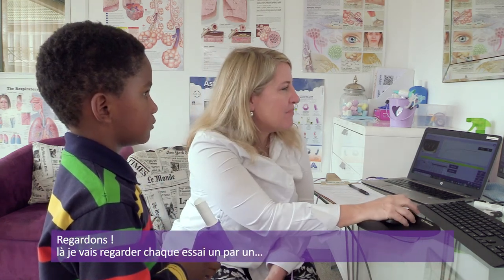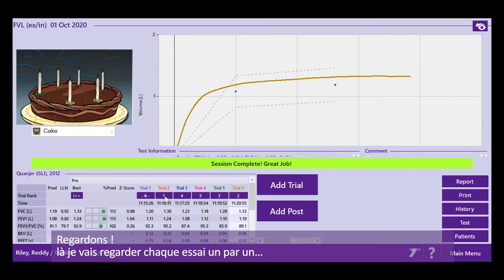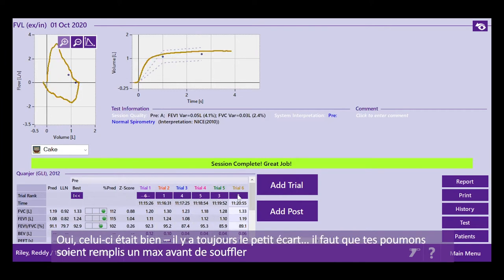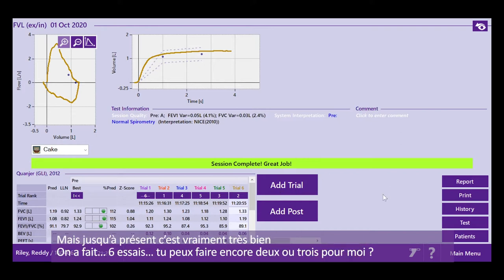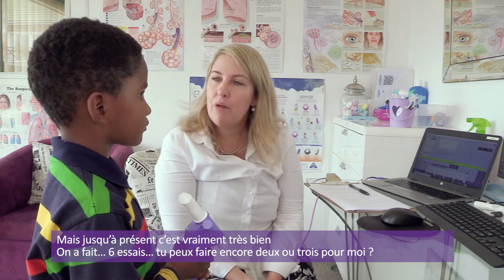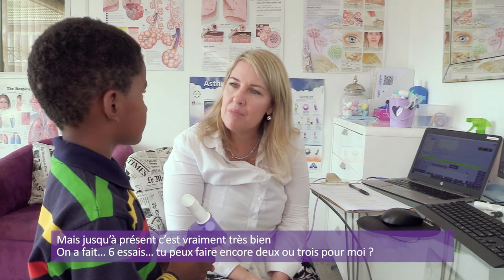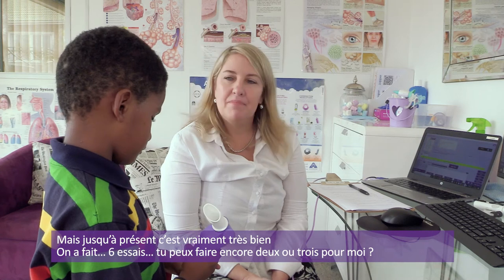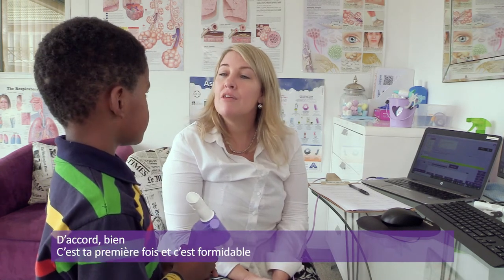Okay, so let's see. Now what I'm going to do is look at each one of them one by one. That one was really very good. Okay, let's look at these one by one. Okay, yes, that one was nice. We've still got a little gap, so we want to make sure your lungs are full before you blow. But so far it's looking great. We've done 6 blows. Are you able to do another couple for me? You're not feeling too tired? Okay, good. For a first try, you're doing a great job.